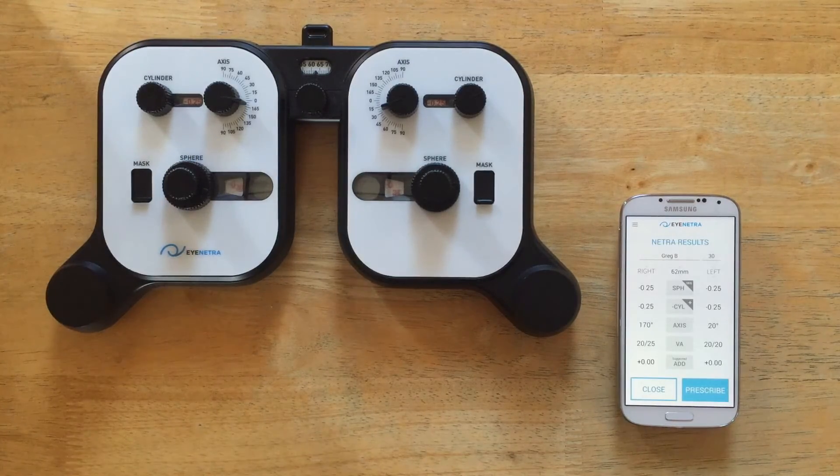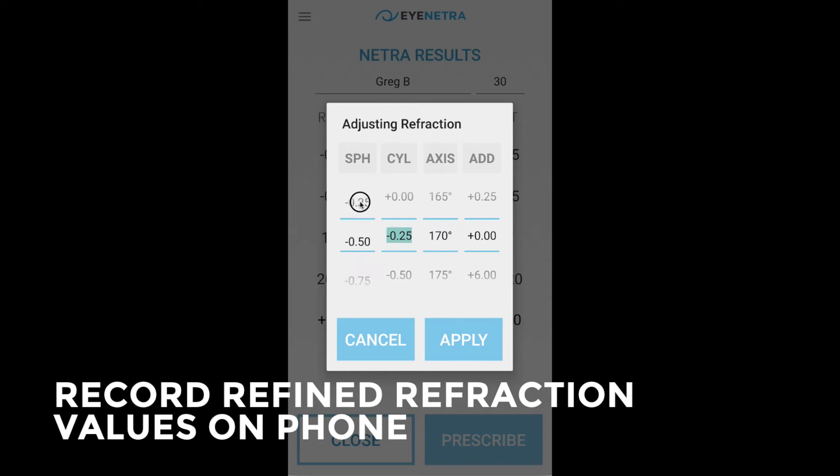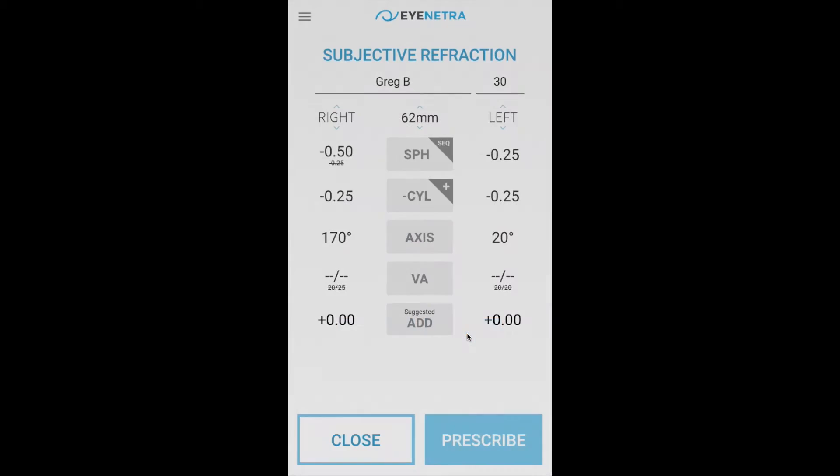Now I will record the refined refraction values on the phone by tapping on the word right and adjusting the slider to 0.5 and click apply.